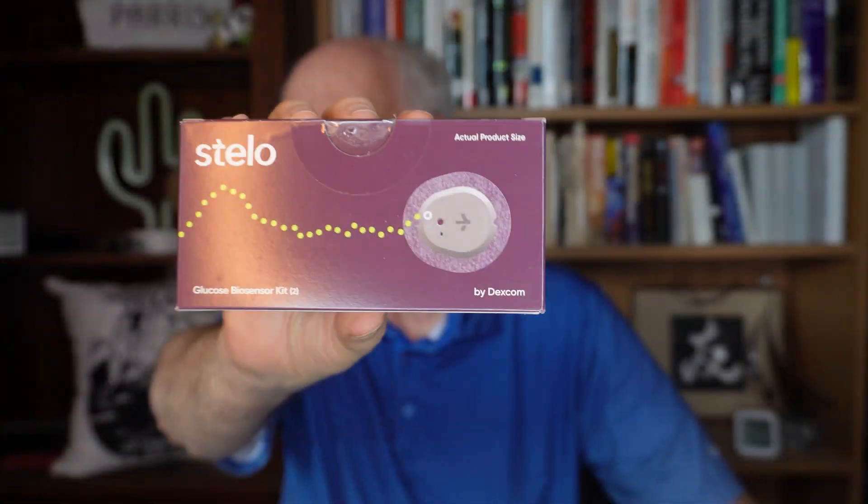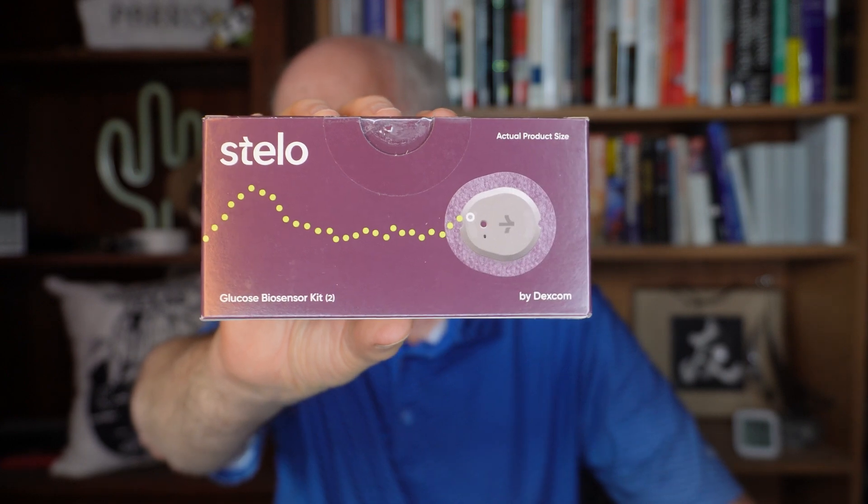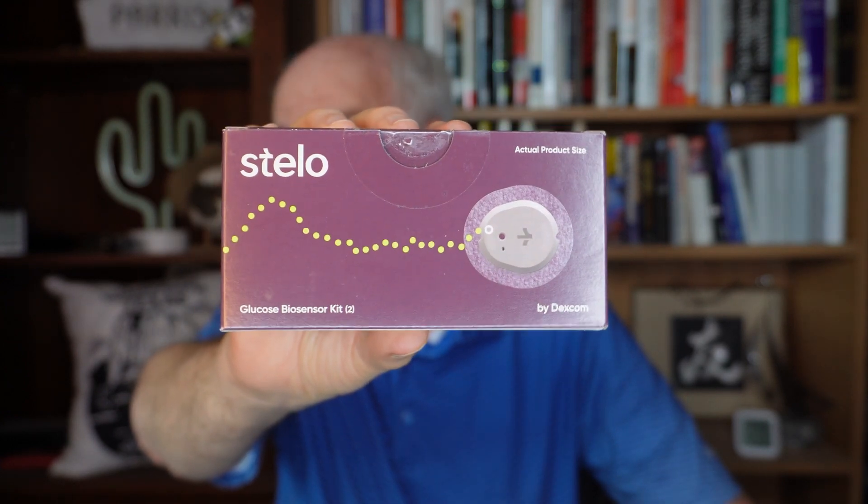Hi, I'm Parris, and I'm excited to have in hand, and soon on the back of my arm, my new Stelo Continuous Glucose Monitor. The Stelo is from Dexcom, and it's the first over-the-counter Continuous Glucose Monitor — no prescription needed. I picked this up for $89 for a month's worth of sensors.